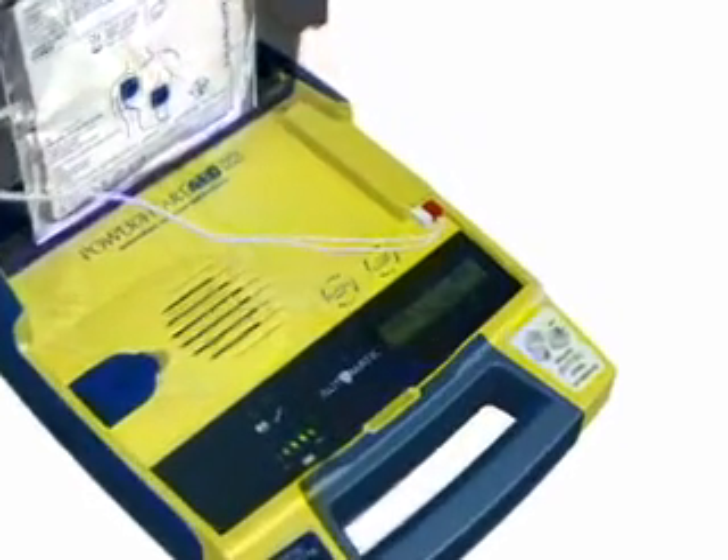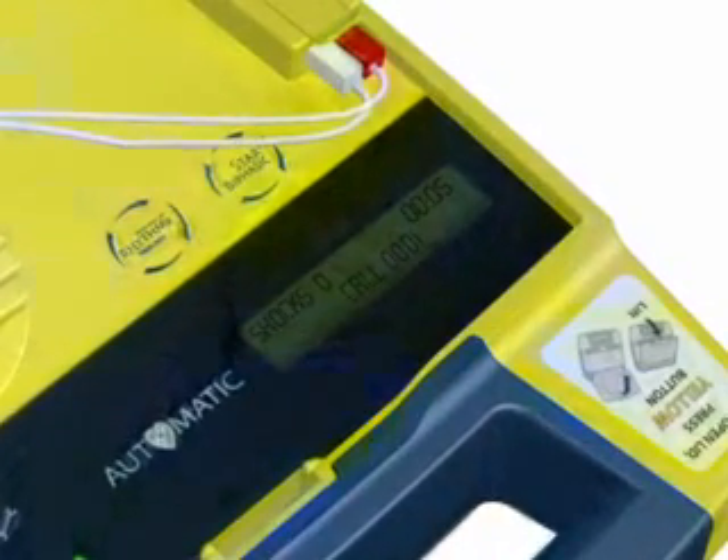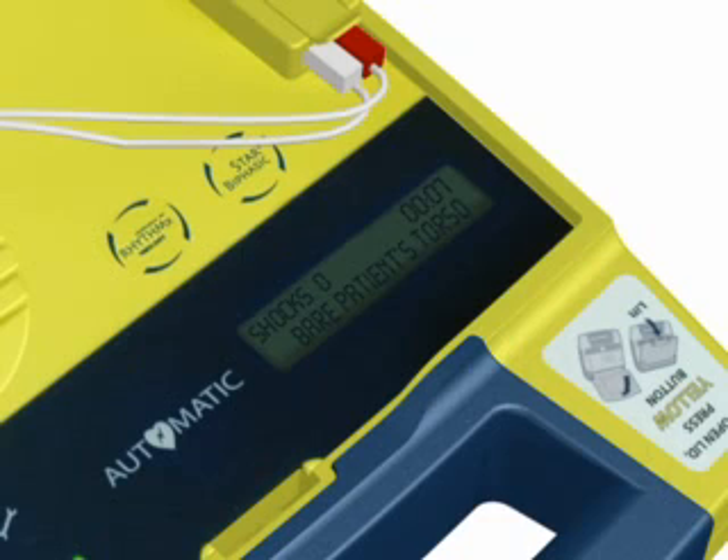Stay calm. Follow these voice instructions. Make sure triple zero is called now. Begin by exposing the patient's bare chest and torso. Remove or cut clothing if needed.